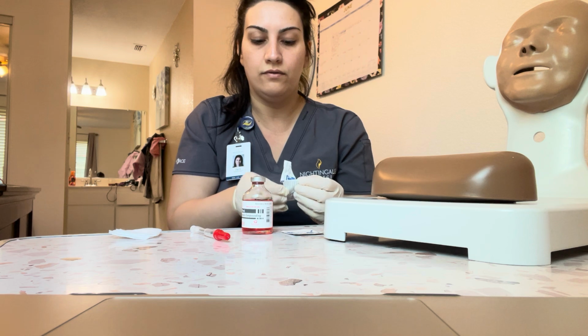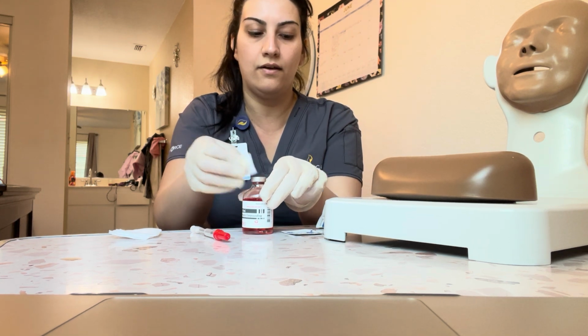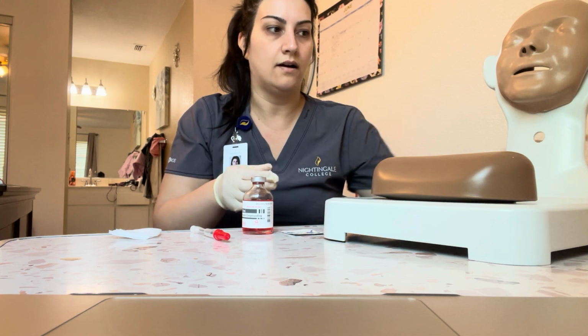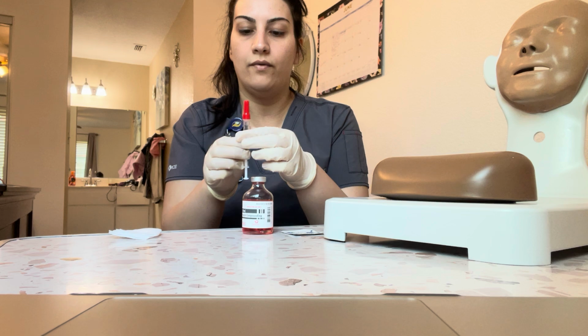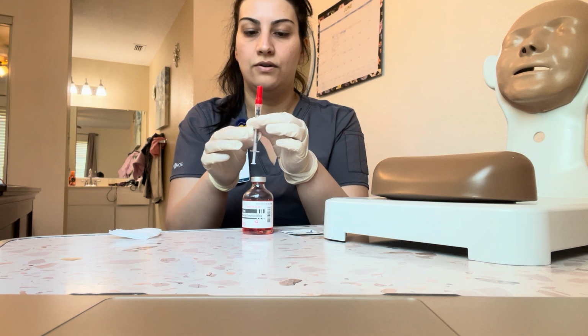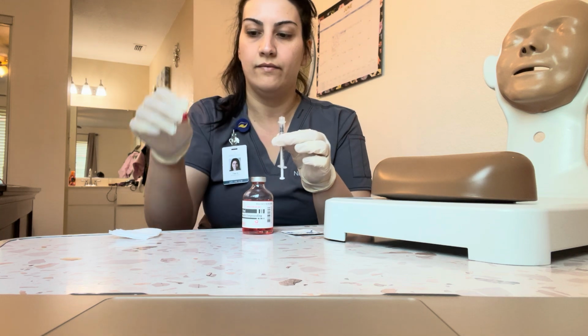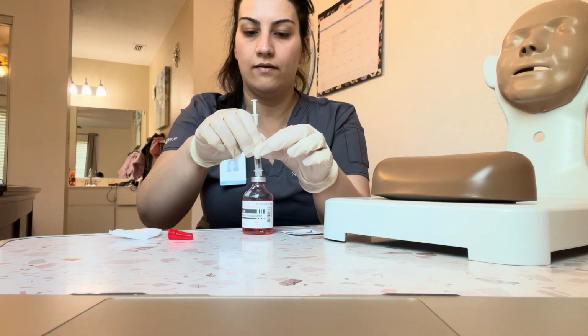We're going to clean the top of the medication vial, discard that, and hold this like a pencil. We're going to take off the cap here and inject the air back in.